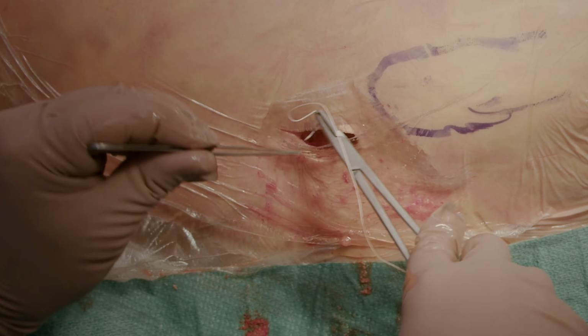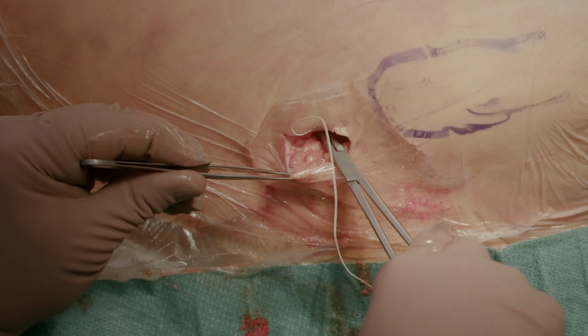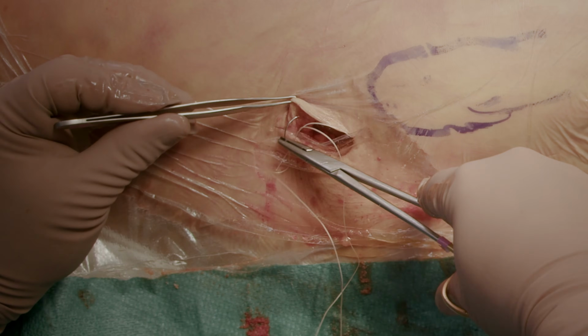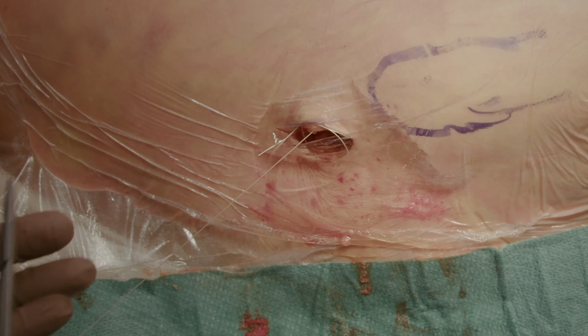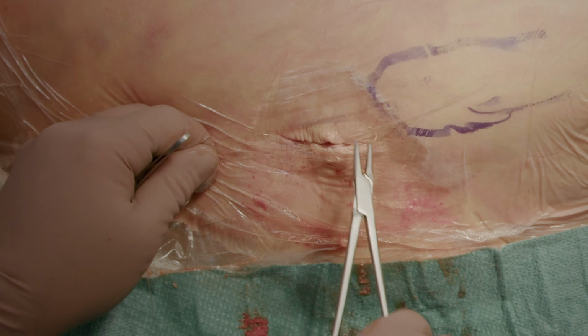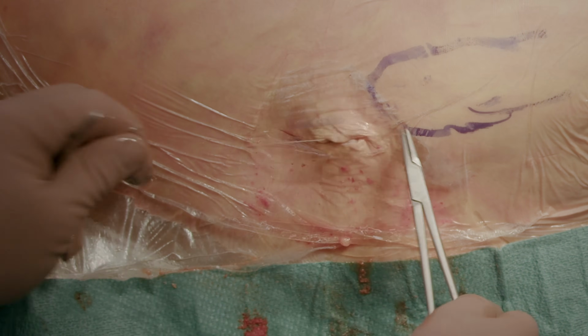Hemostasis can be checked again, and if necessary, cauterize the bleeding. Then the skin sutures.